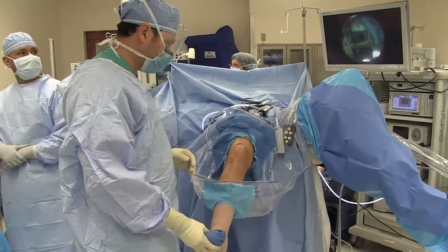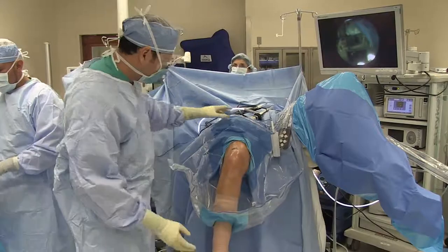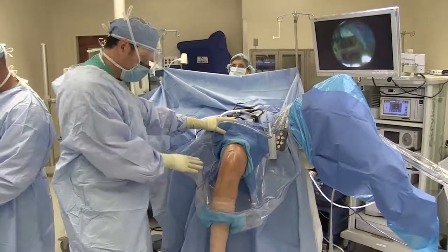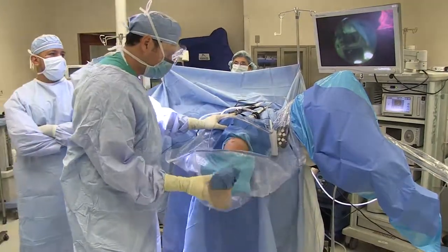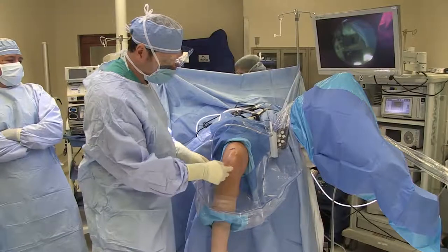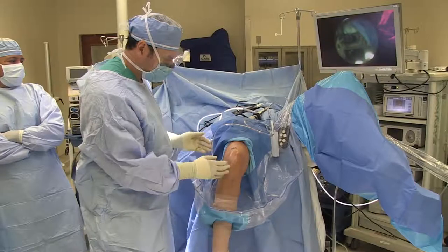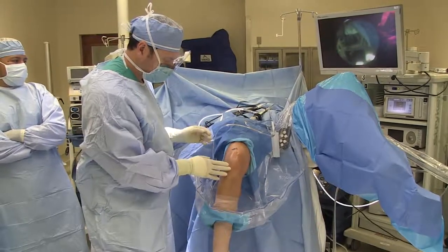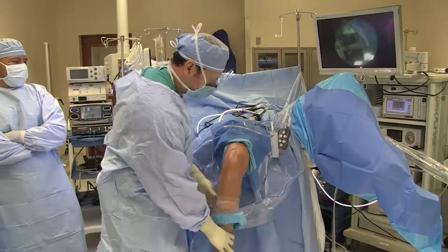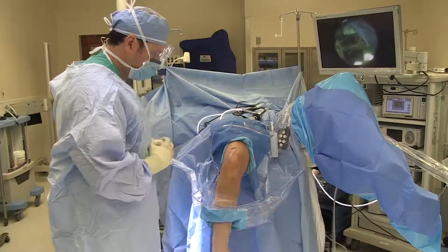For a Prochondrix procedure to the femoral condyle, we have the patient positioned with a leg holder which holds the femur in position. We have the table broken so that the knee can move freely. When we make an arthrotomy and the lesion is staring right at us, we operate with the knee as is. If it's not in the ideal position, we can remove the top of the leg holder, take the leg into more flexion, and place the foot onto a Mayo stand to give us hyperflexion.